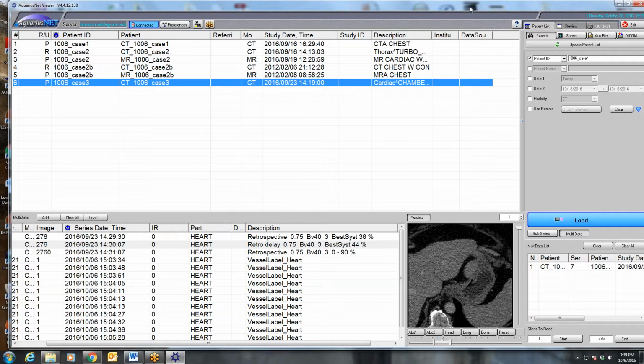Isn't IgG4 usually more a periaortitis than an aortitis? Yes, they talk about the sclerosing periaortitis, but I've seen both. You're right, it's most commonly the sclerosing. It involves predominantly the ascending aorta, and you can get calcification in the wall. You're right, that's classic.